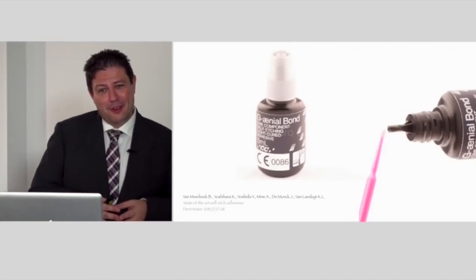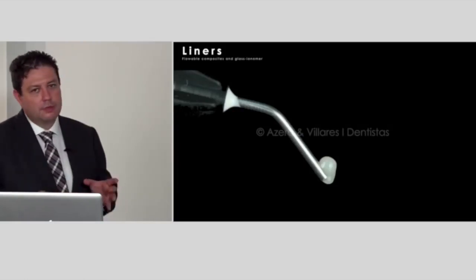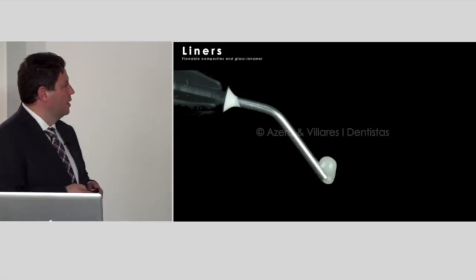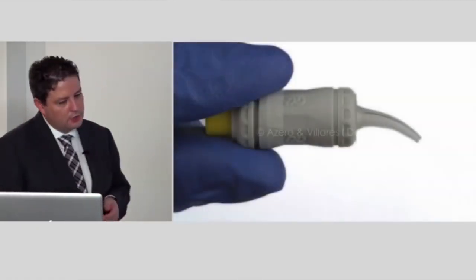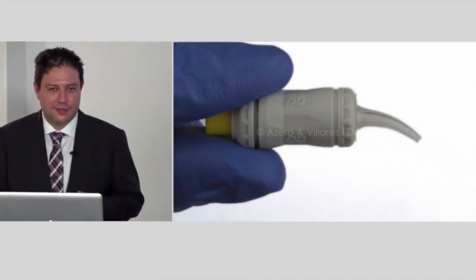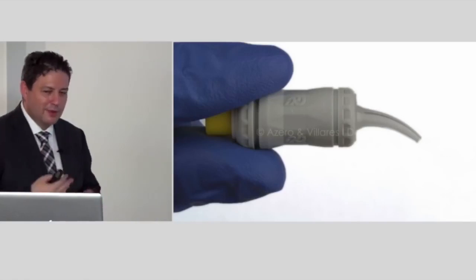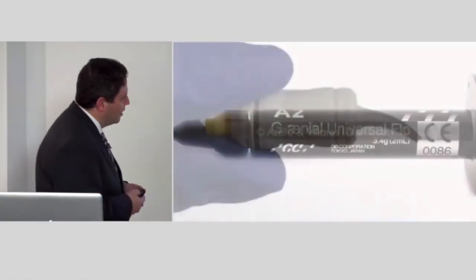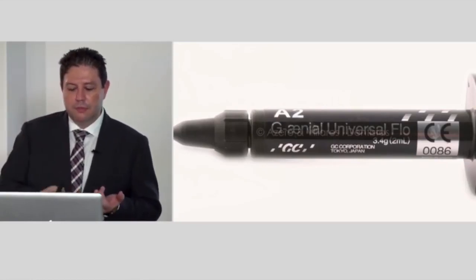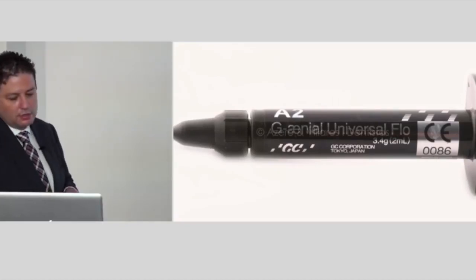Another controversial point about composite resins is the liners. Do we use them or don't we? When we talk about liners, we only talk about two: flowable composite and glass ionomer restorative material. Now, the use of glass ionomer is increasing because we're doing more prevention and being less destructive. We eliminated so much tooth in the past, and now we know that if we don't eliminate it, we will have better results. And about the flowable composite resin, what we need is a good material that is easy to place and doesn't have so many bubbles, so you have a good result.